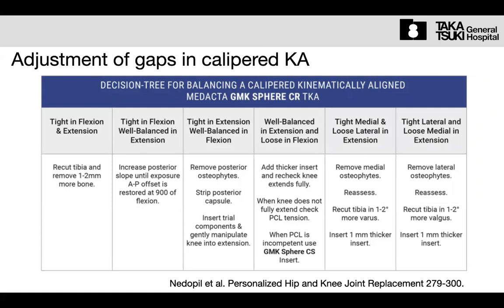So we don't change the femoral component. But in the normal procedure, such as mechanical alignment, it's quite simple to change to a smaller component, then we can reduce the posterior offset on the femur, so the flexion gap can be enlarged. But we don't want to change the femoral articular surface. So another solution is to make a steeper posterior slope.